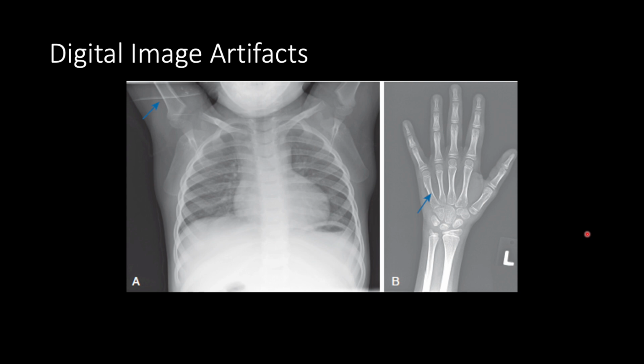So if you're using computed radiography where you have image plates, make sure that you are cleaning the screens properly with the screen cleaner that comes with it. And make sure they're being cleaned regularly to get any dust or dirt or anything like that off of there so that it does not create a digital image artifact.